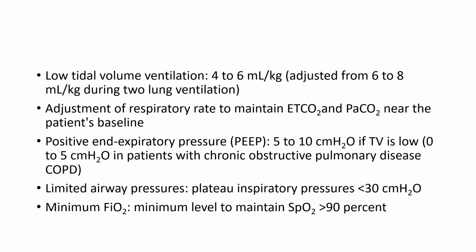We recommend low tidal volume ventilation, which is 4 to 6 ml per kilo. Okay, and adjustment of the respiratory rate to maintain the patient's normal EtCO2 and PaCO2. PEEP is adjusted from 5 to 10 cm H2O, and we also limit the airway pressure, with plateau pressure less than 30 cm H2O. And we have to minimize the FiO2 to a minimum level to maintain SpO2 of more than 90%.